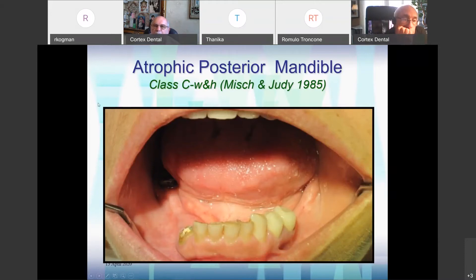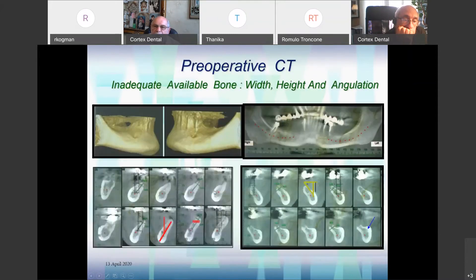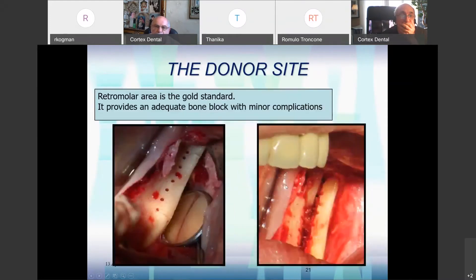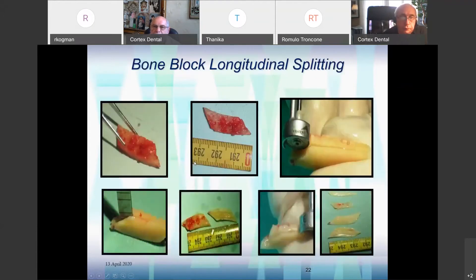This is another case with atrophic posterior mandible. Many times we encounter this situation. You see the angulation of the crest, and we do not want the implant going in this angulated direction — we want the implant straight. So again I harvested from the retromolar area. Actually, this is a case of one of my consultants, Fares Kablan. He perfected the system — longitudinal splitting. From one block, we have four pieces.